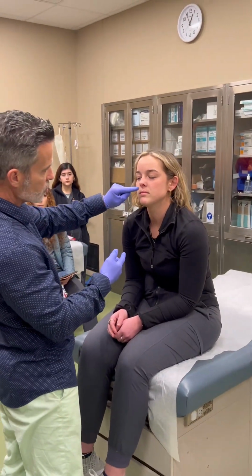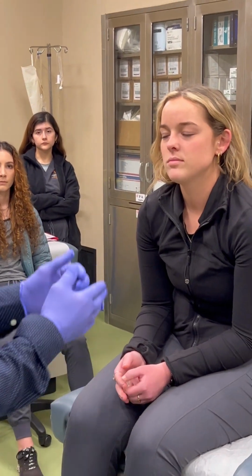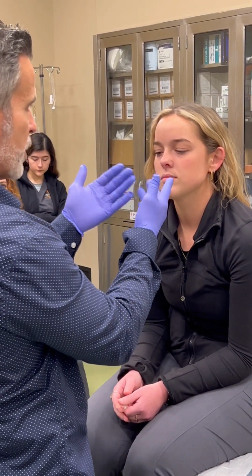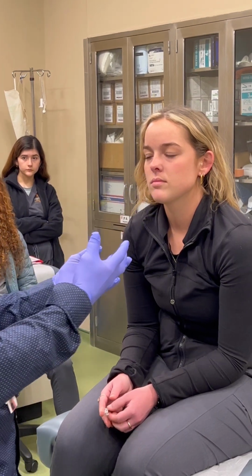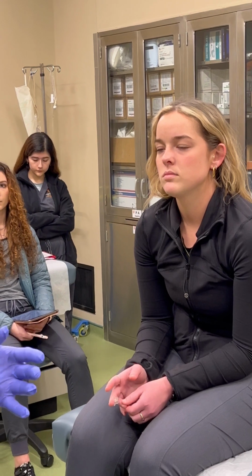Many of us, our nostrils are different openings. If you look at my nostril, one's wider than the other nostril. It's just the way it is. And so looking, make sure it's somewhat symmetric. You don't see anything, so you're just inspecting first. Inspects with otoscope. I'm observing the nasal mucosa and septum.